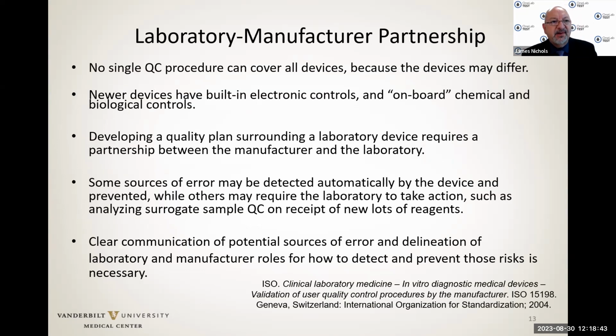What we have to realize is that no single quality control procedure, like 2 levels of liquid QC each day of testing, is going to cover all devices because the devices differ. And newer devices have these built-in electronic controls, onboard chemical, biological controls. So developing a quality control plan, an IQCP, surrounding a laboratory test and testing device, it really requires a partnership between the manufacturer and the laboratory.